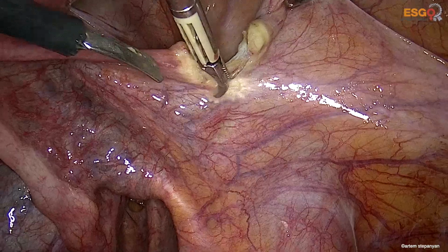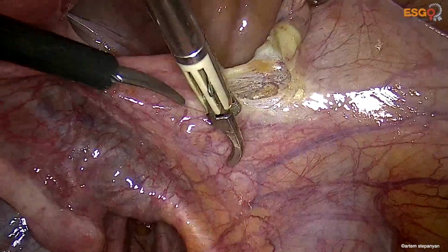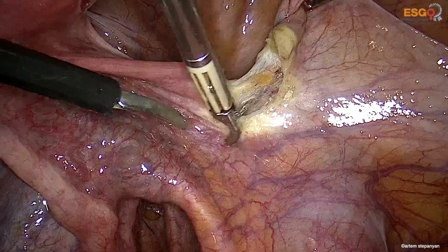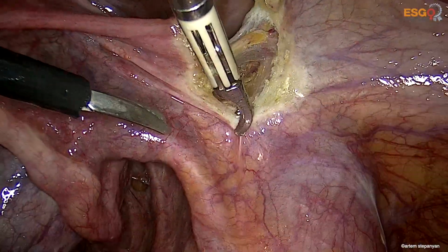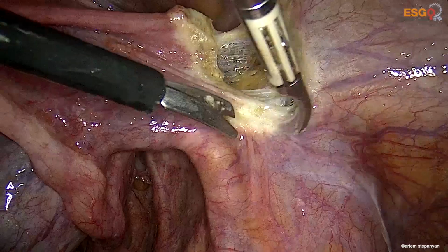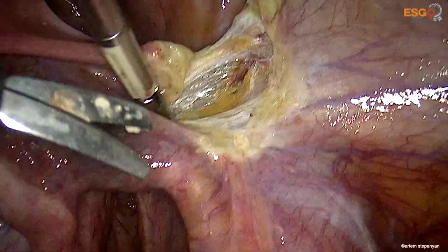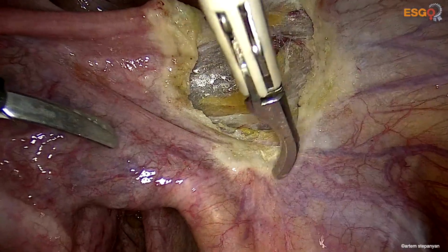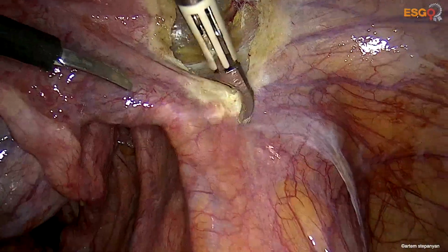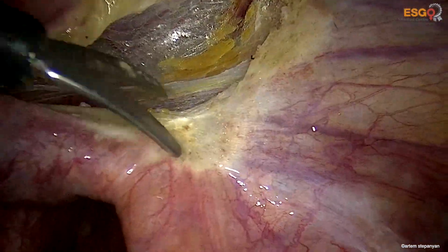And next we do the same on the right side. The round ligament of the uterus is coagulated and cut, and the incision is advanced cephalad in the same fashion as it was done on the left side.